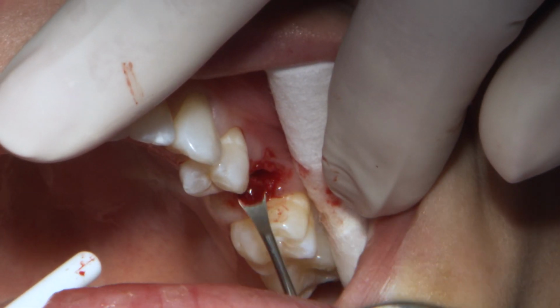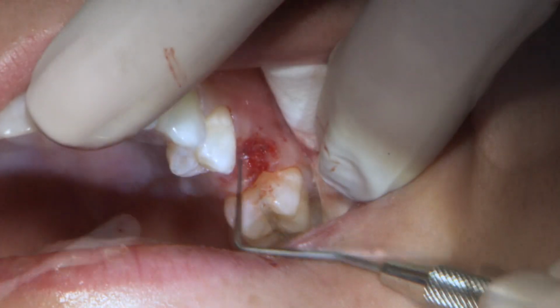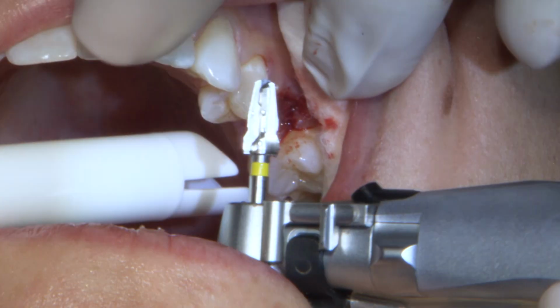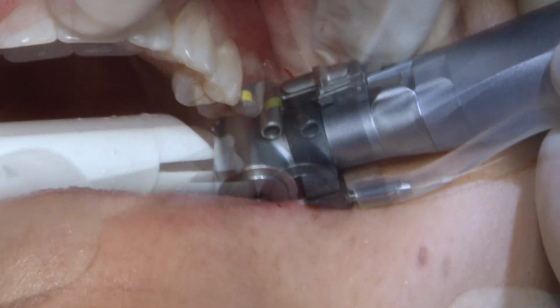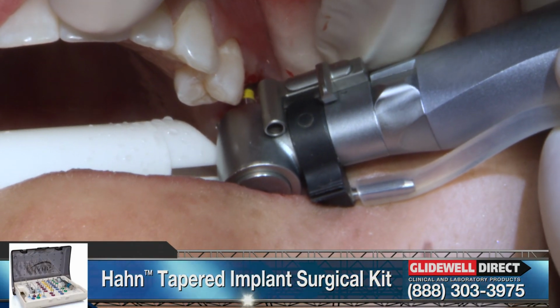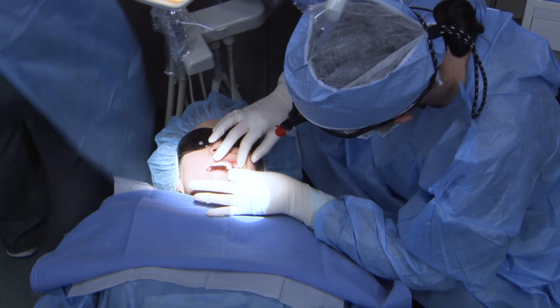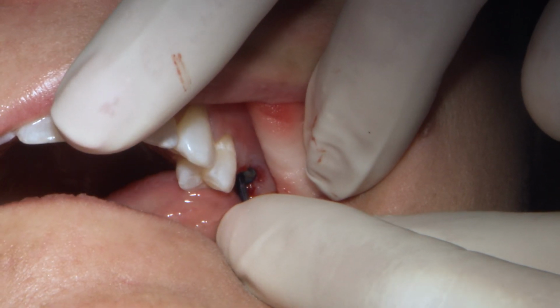On the other hand, we have to make sure we reintroduce blood flow to the site, whether we decide to graft or place another implant. We are hoping to place another implant today. Therefore, the easiest way to do this is to use our shaping drill. This drill will help us ensure our osteotomy is the correct shape while exposing fresh bone, allowing blood flow to this area. This blood flow will bring with it the necessary growth factors that we need for successful integration.